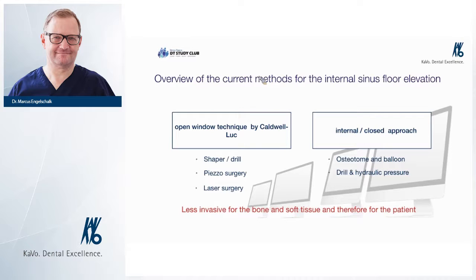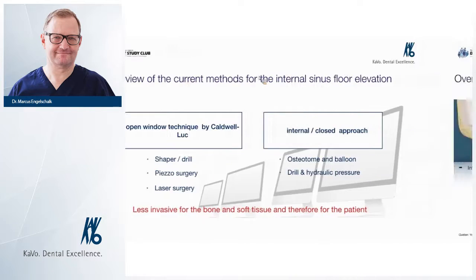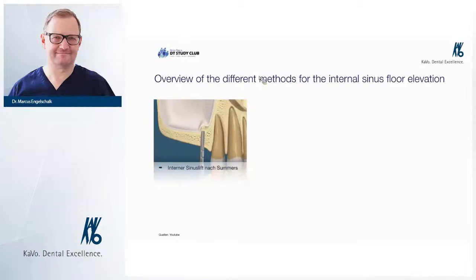So another picture from the same case. You see the implants, the needed amount of bone for the sinus floor elevation, and this gives us more help, more good feelings if you start your implantation or your operation or your augmentation. Otherwise, you would start and say, well, patient, let us see what we can reach. And this is not the surgery of today, I would say.